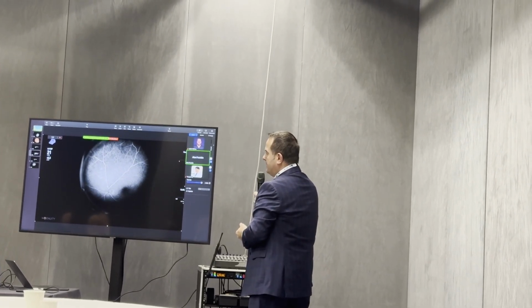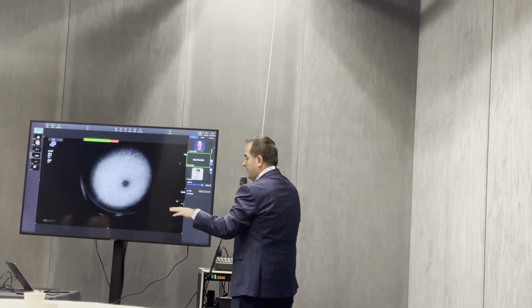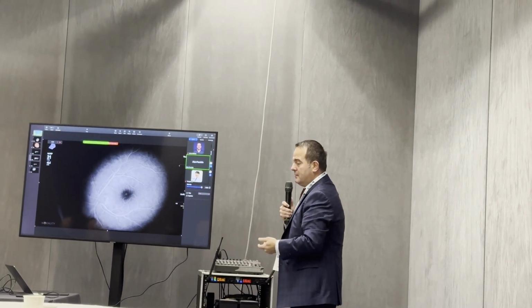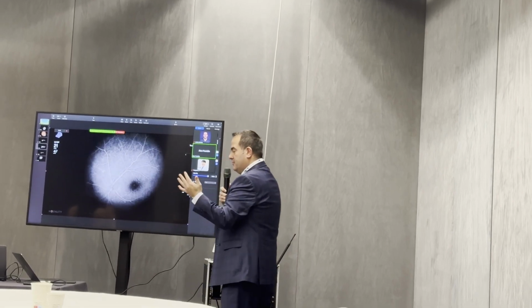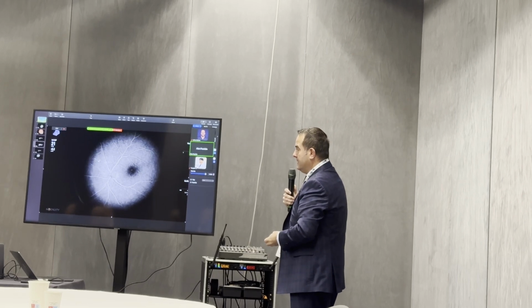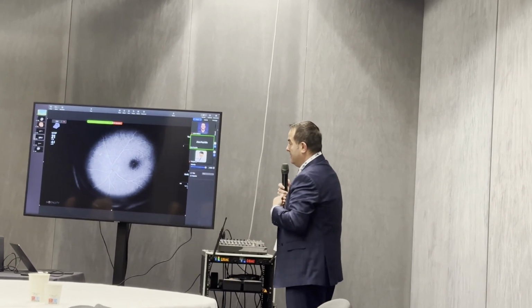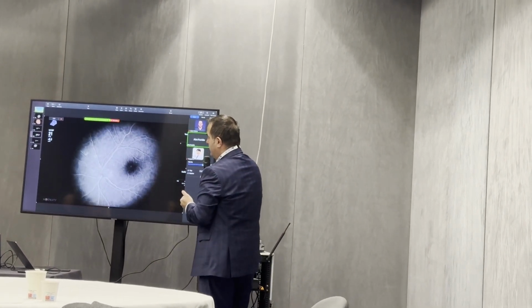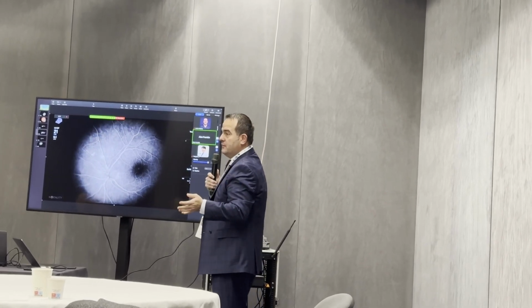I must say that for me, the most important part, apart from the digital barrier filter, is actually the illumination source. I played a lot with the Photon, with the Constellation, with the dark LED, with other sources, and up to now I found that the xenon-based source is the best working in my hands. So just to show you here that it looks almost the same as a regular fundus camera.